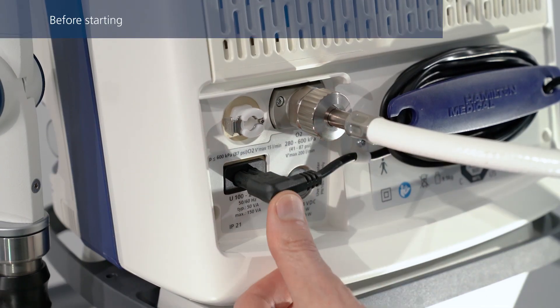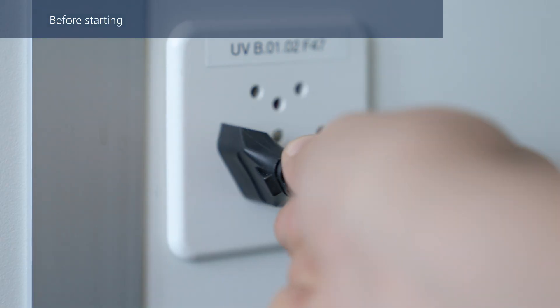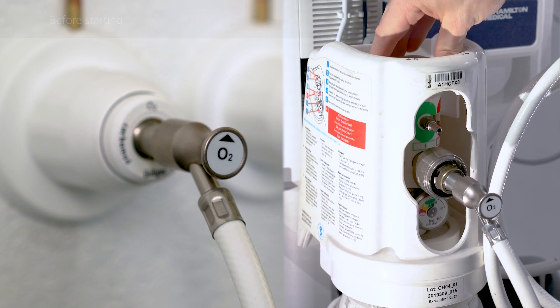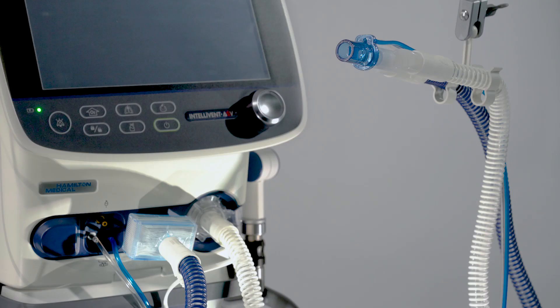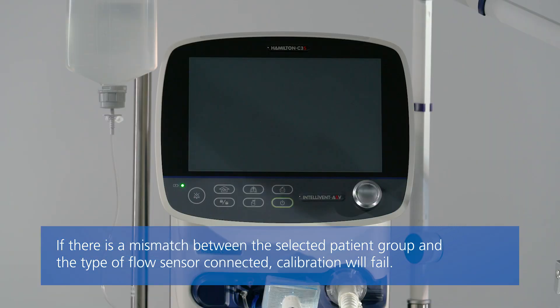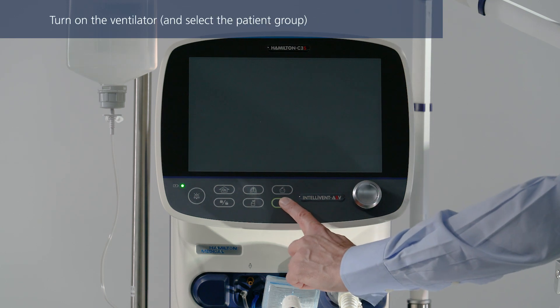Before starting with the pre-operational checks, ensure that the ventilator is connected to both primary power and an oxygen supply. Ensure you are using the correct flow sensor for the patient. Verify that the breathing circuit is assembled correctly.